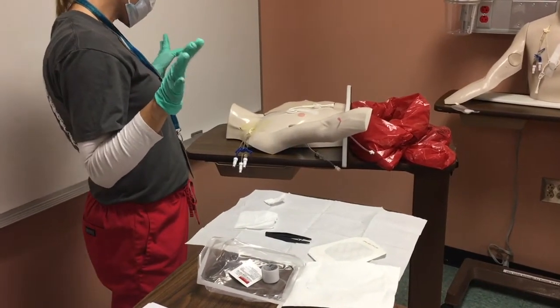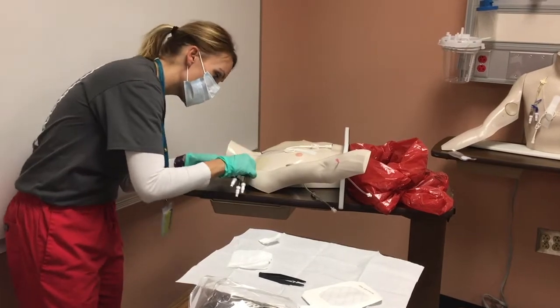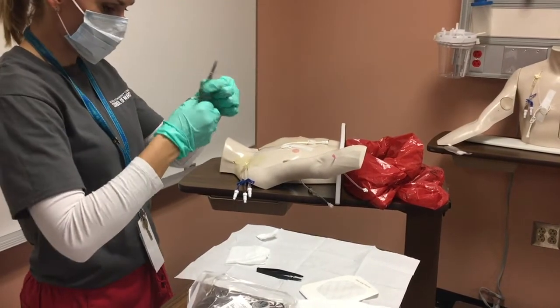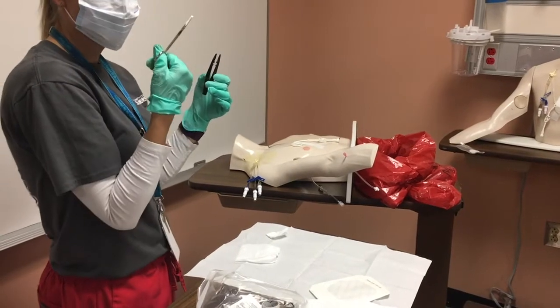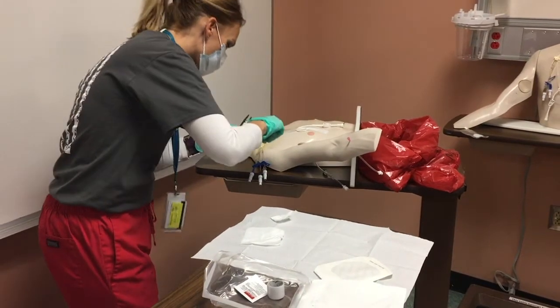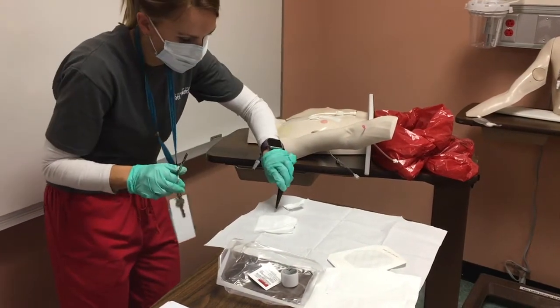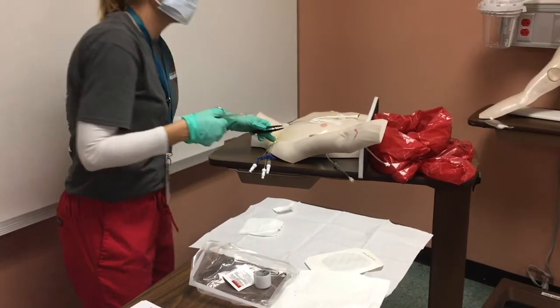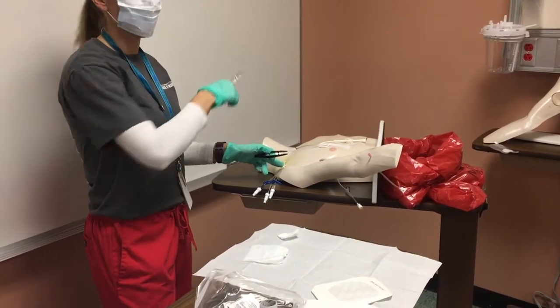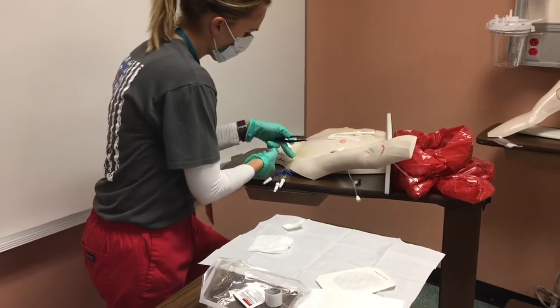I've measured, I've cleaned, and now I'm ready to cut the sutures. The sutures are actually on the winged parts — there are two on each side. I'm going to get my scissors and my tweezers. You're going to cut with the scissors and then remove and put them down. You come around and snip, then pull it out. Go to the other side and snip. Once you cut the last suture, you need to put a hand on it — if you let go and your patient coughs, that thing could fly out. You need to hold on to it once it's completely cut.